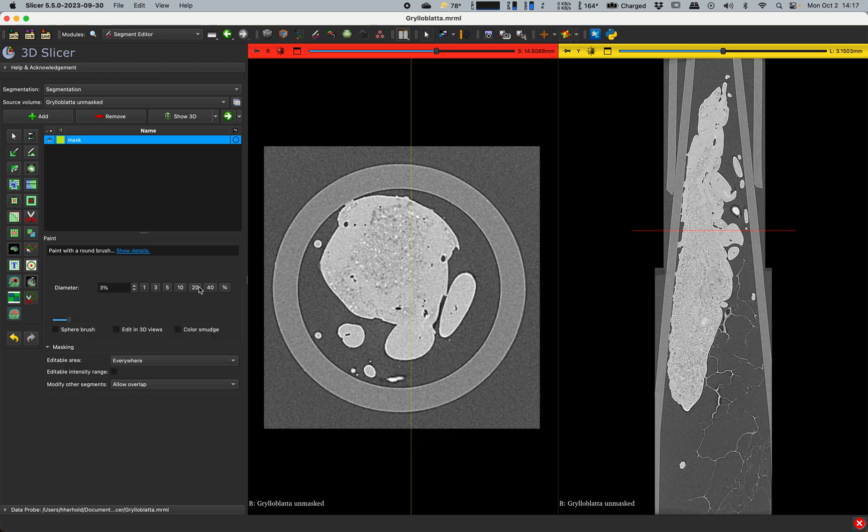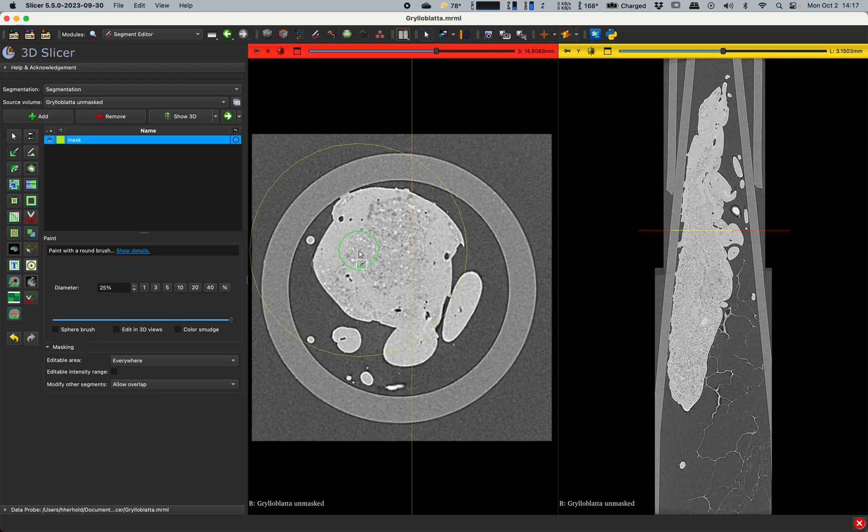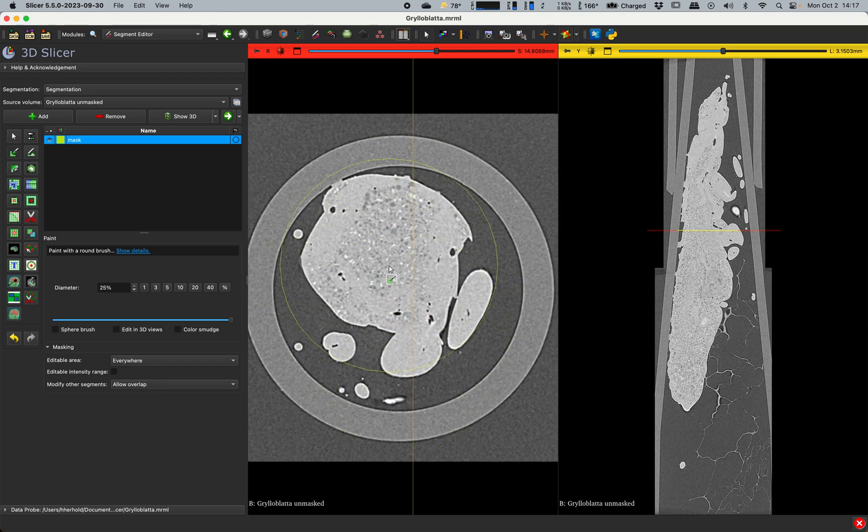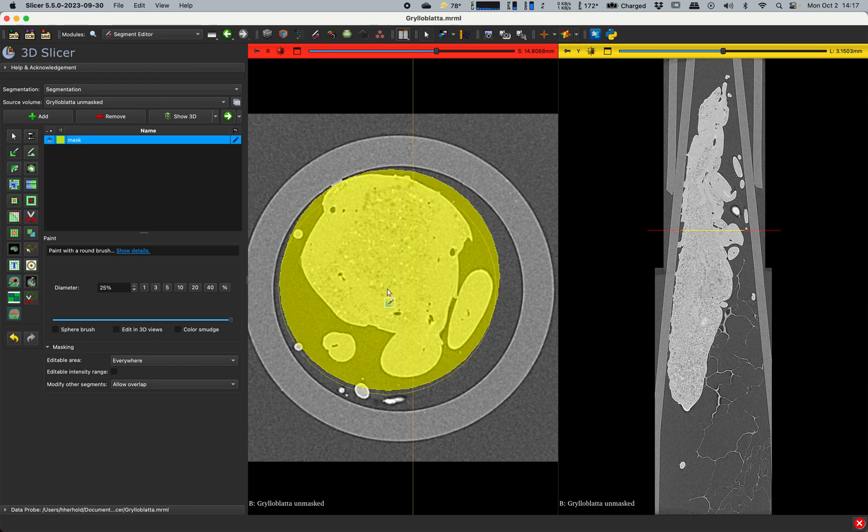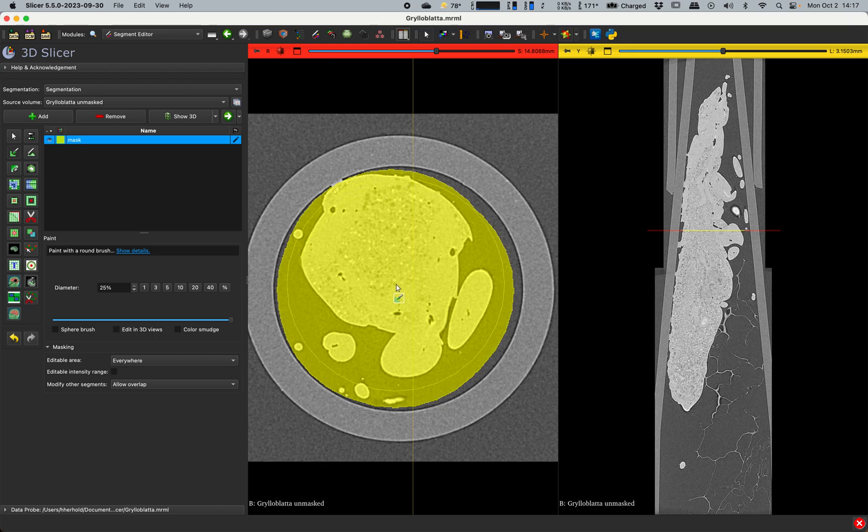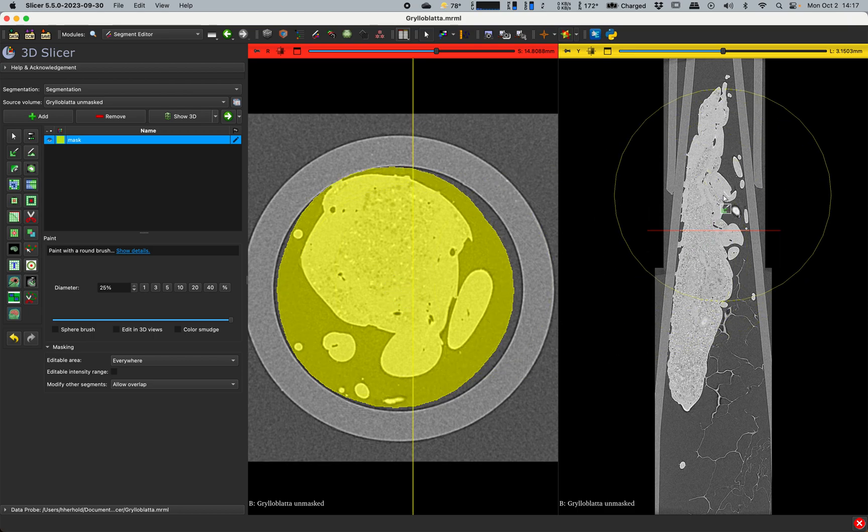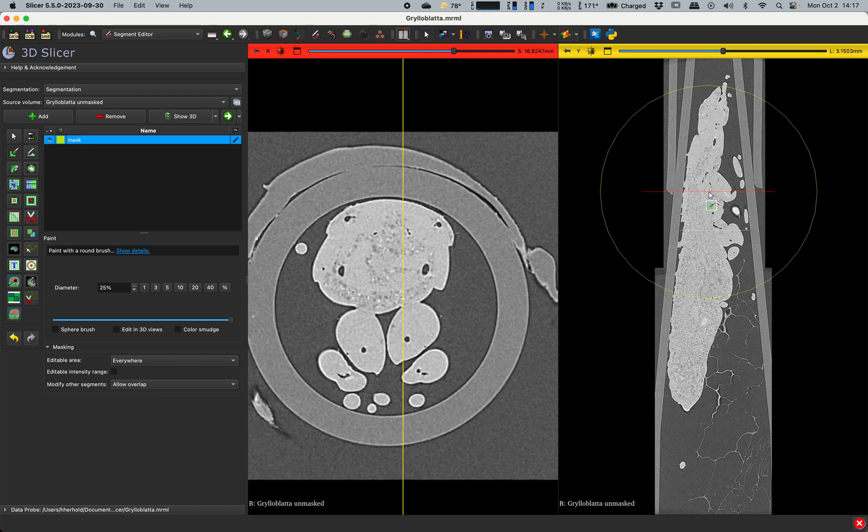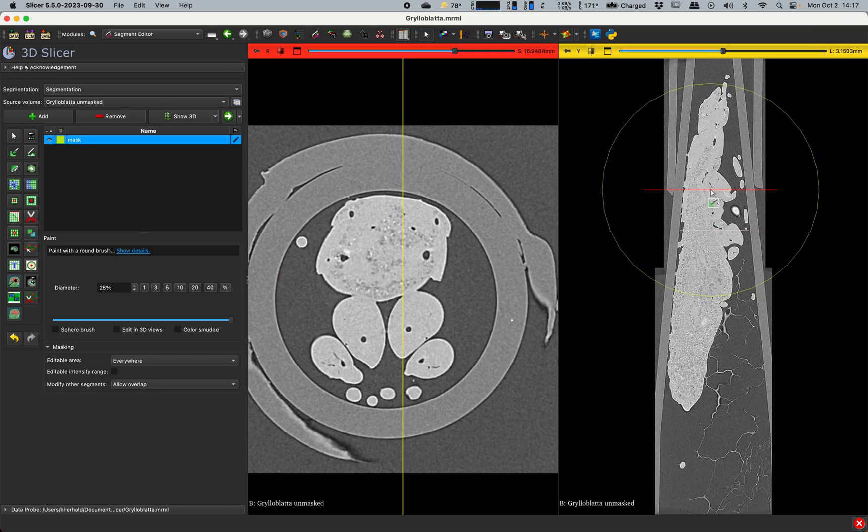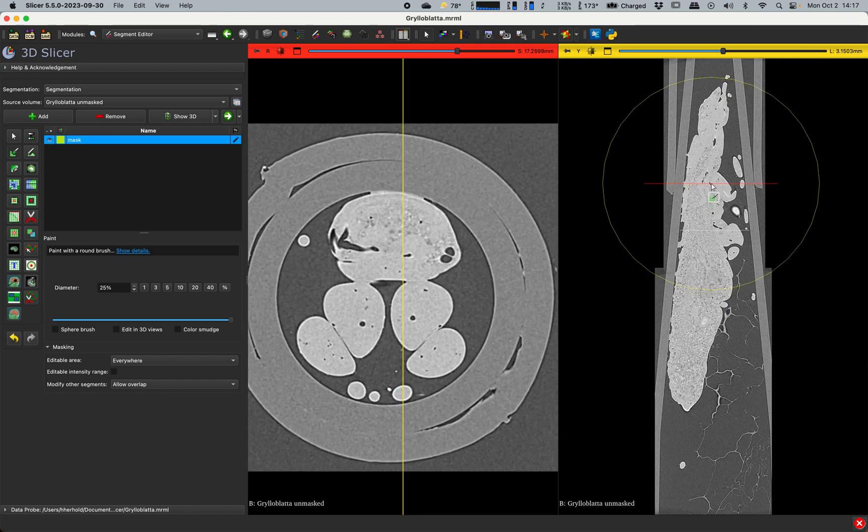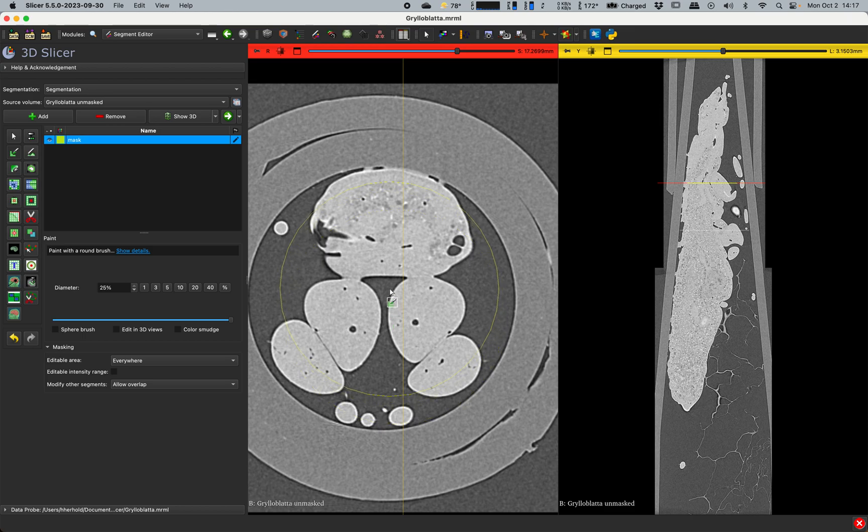I'll fill in between them and then use that as a mask to mask off everything else. So that was kind of a lot of words to describe what I'm about to do, but you'll get the idea when I start looking at it. So I'll use paint and we are going to not use the sphere brush. We're just going to use the standard flat brush here. Make it kind of as large as possible here. Not too large. And I'm going to just start anywhere and I'm going to paint everything that I want to keep.